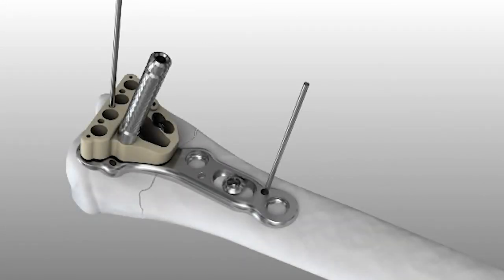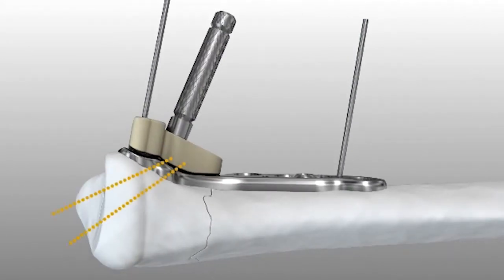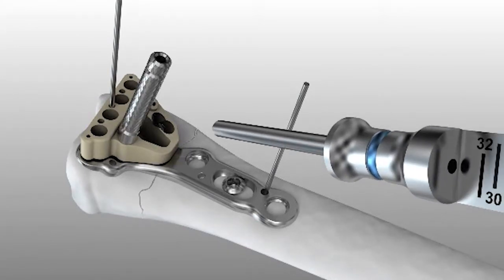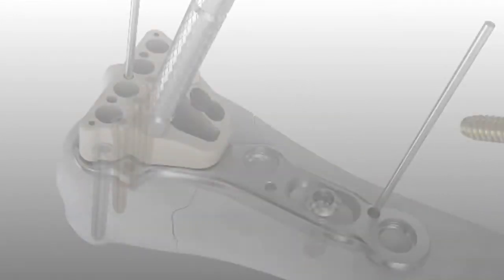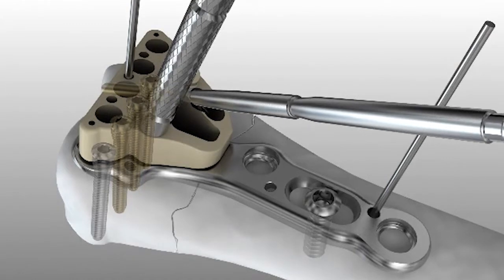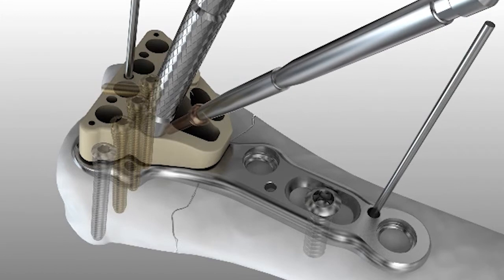The two radial styloid screws are approached from the back of the targeting guide. The radial styloid screws are designed to specifically target and support the radial styloid. Insert the drill guide into either styloid hole located in the dual slot on the back of the targeting guide and continue the same screw placement process for both styloid screws. Be sure that the radial styloid screws are fully seated before removing the guide. Alternatively, the guide can be removed after drilling to increase visualization of the holes when inserting the screws.